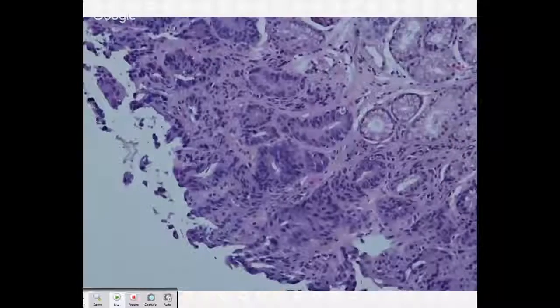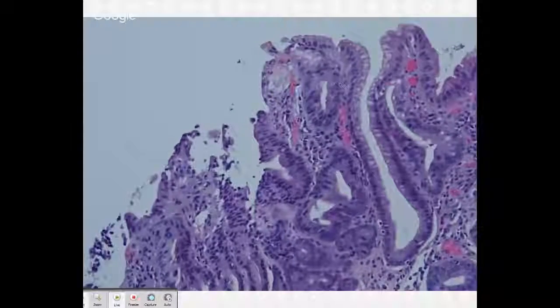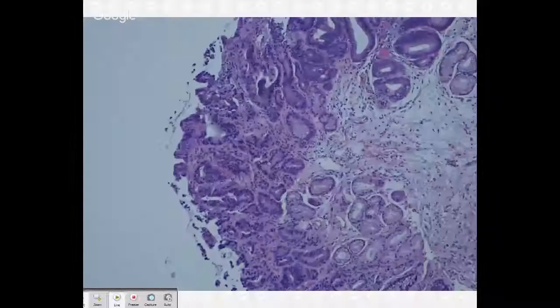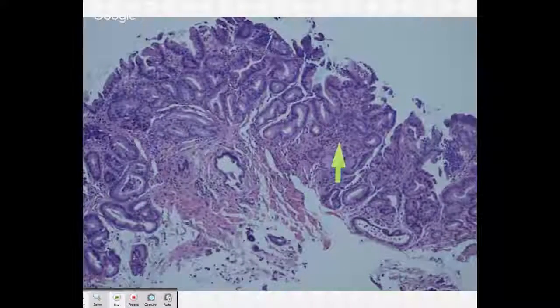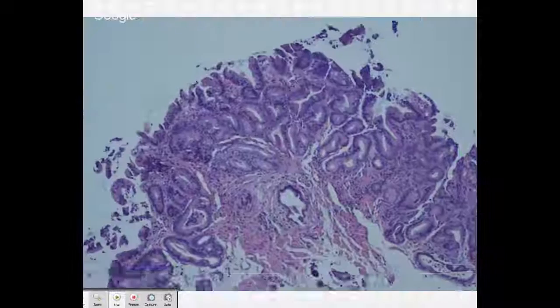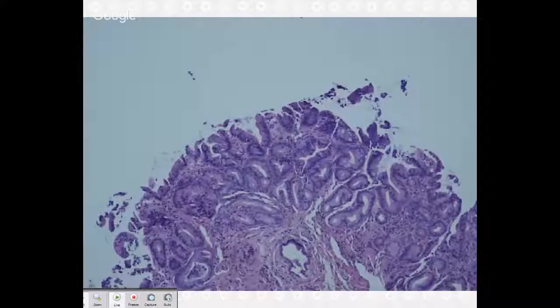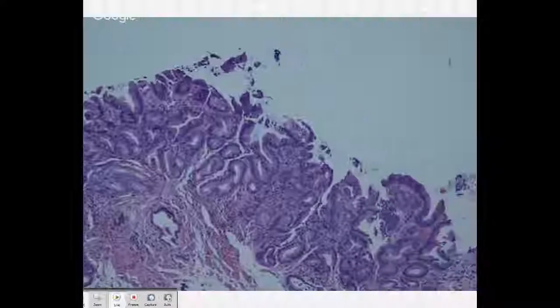Piled up large nuclei, apoptotic debris. So this is a high-grade Barrett's case, yes? Yes. Could even be worse, possibly. But what I have on this slide is definitely a high-grade Barrett's. Even this stuff here that looks much more bland. It's back-to-back, and those nuclei aren't normal cardia nuclei, right? They're not normal esophageal nuclei. They aren't the normal cells that you see in low-grade dysplasia. So all of this is a high-grade Barrett's pattern.